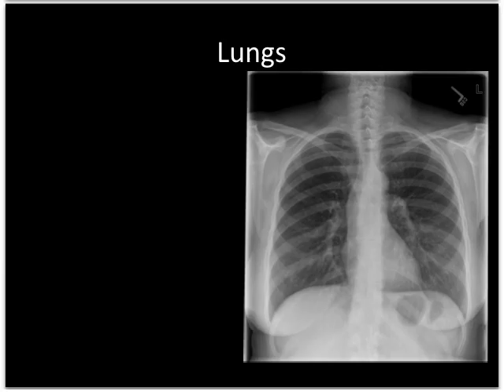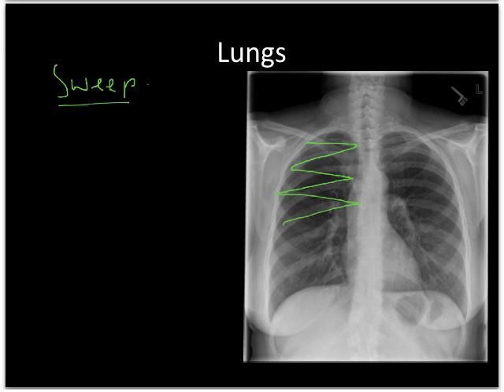Now we're going to get to the part where we're actually looking for abnormalities. I always start with the lung parenchyma. The way I search them is in a very systematic approach — I start by doing a sweep of both lungs. I use what I call the lawnmower approach: I cast my eyes back and forth. Remember, the lungs come behind the hemidiaphragms, so you want to keep going there — don't stop when you get to the diaphragms.